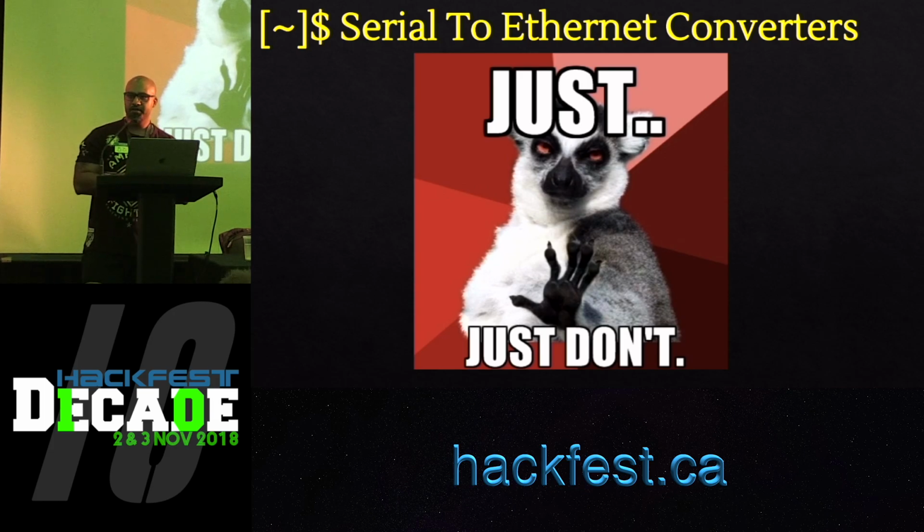So the Department of Homeland Security in 2015 issued an alert against one of the most commonly used serial to Ethernet converters, which is NPort, developed by a company called Moxa. A bunch of vulnerabilities were discovered and reported in NPort.